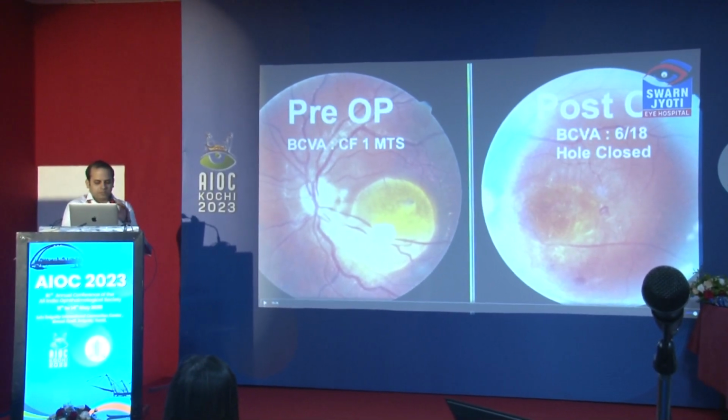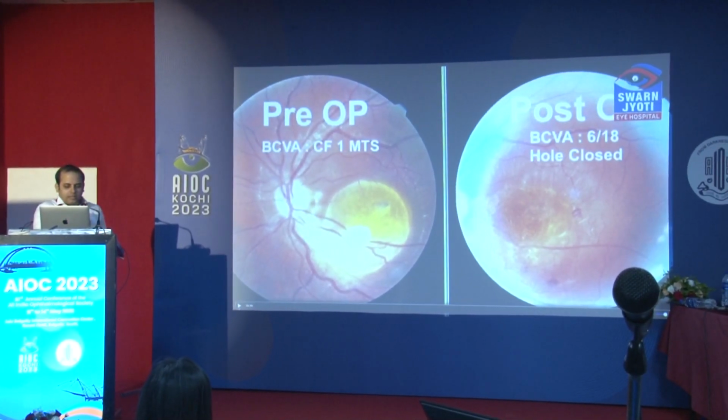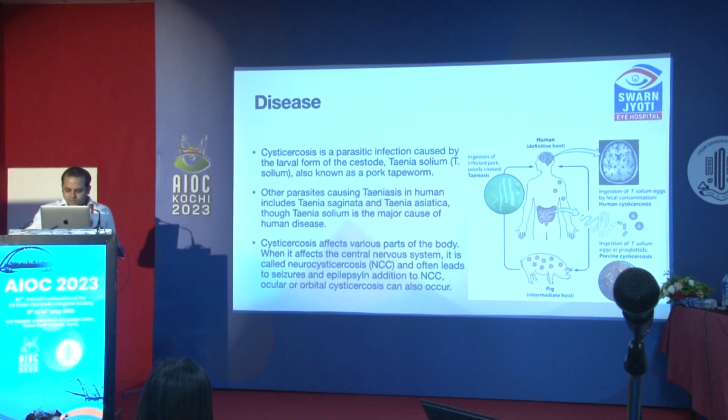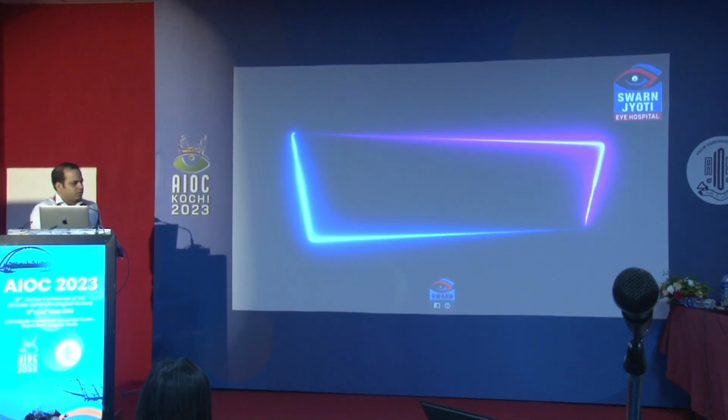So the retinotomy, I felt, was a bit on the bigger side, so I thought it would be prudent to laser it. And I felt that the macula looked quite fragile. So an ILM peeling or something of that sort would have been very difficult in this situation. But the hole closed well post surgery, and it was not due to any tangential traction or anything. So I think we would get results without ILM peeling in this.